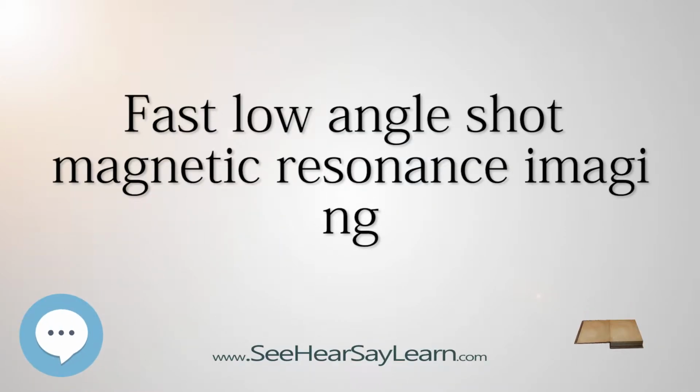Fast low-angle shot magnetic resonance imaging, FLASH MRI, is a particular sequence of magnetic resonance imaging. It is a gradient echo sequence which combines a low flip angle radio frequency excitation of the nuclear magnetic resonance signal, recorded as a spatially encoded gradient echo, with a rapid repetition time. It is the generic form of steady-state free precession imaging.